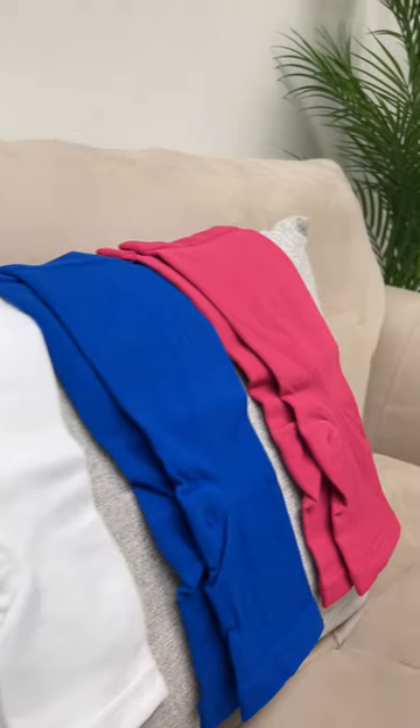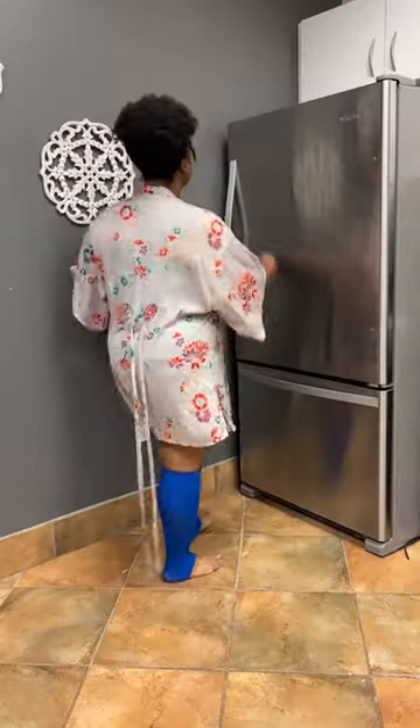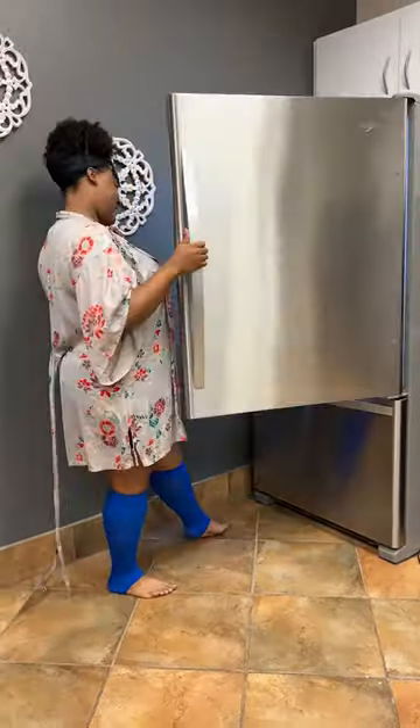I also appreciate the color selection and the fact you get two pairs with your purchase. These come in six different sizes, and if you're not sure about your size, I recommend sizing up.